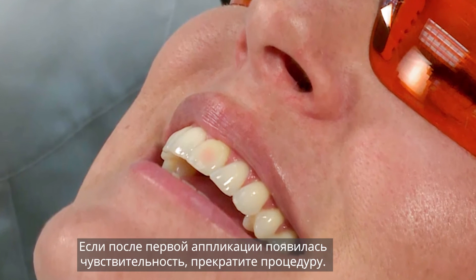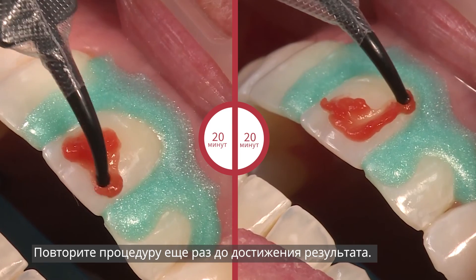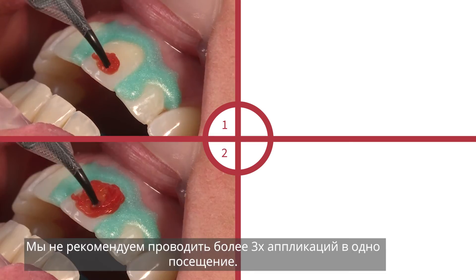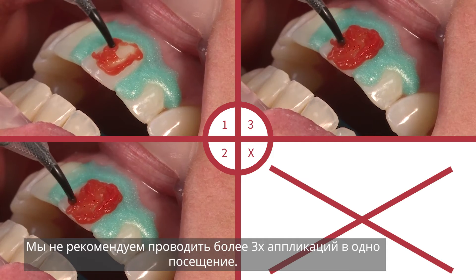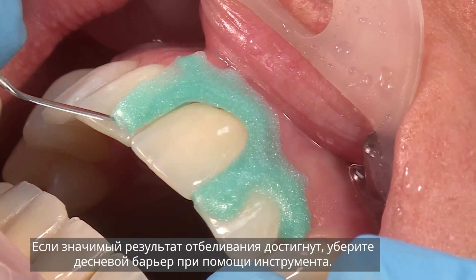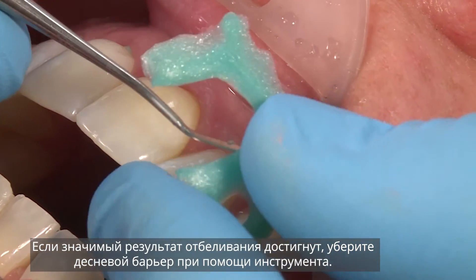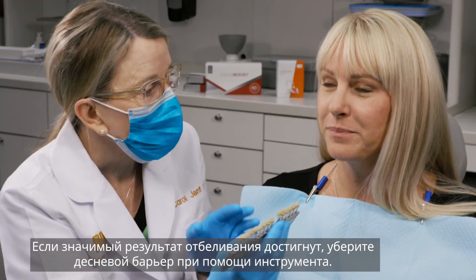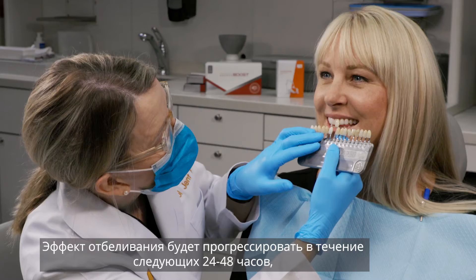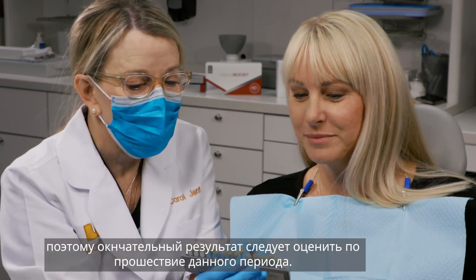Evaluate shade change after each application and monitor patient for sensitivity and irritation. If persistent tooth sensitivity occurs, discontinue use. Repeat application one to two times or until the desired results are achieved — we do not recommend exceeding three applications per visit. Once the desired shade of white is achieved or you have completed three applications, use a dental instrument to remove the cured Opal Dam resin barrier. Whitening effect may continue for 24 to 48 hours following whitening, so a slight increase in whitening may be realized during this period.